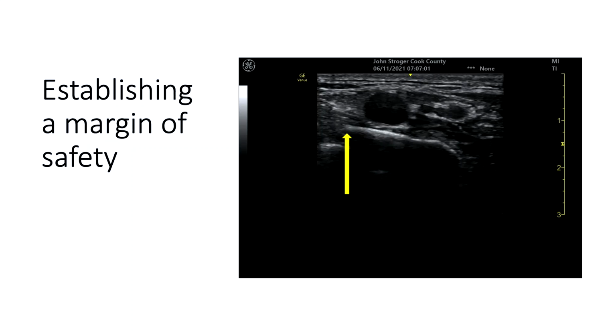So you will not have a first rib that is starting there and then extending lateral. It looks exactly the same. It looks as safe. Both look similar. But notice that in 3 dimensions, this edge is going to start receding toward you.